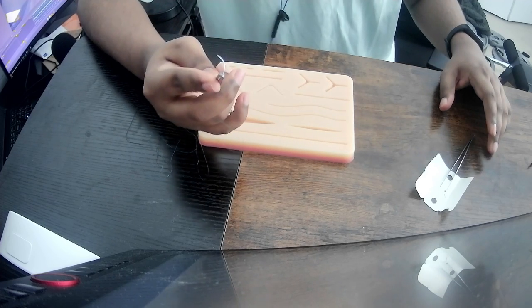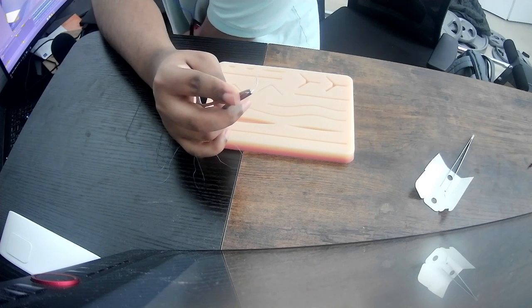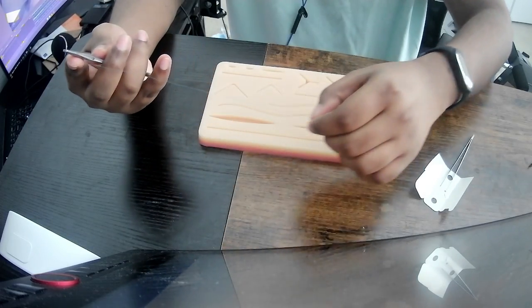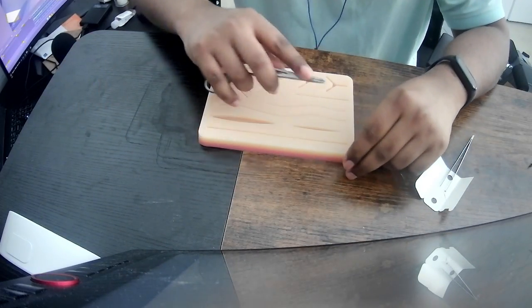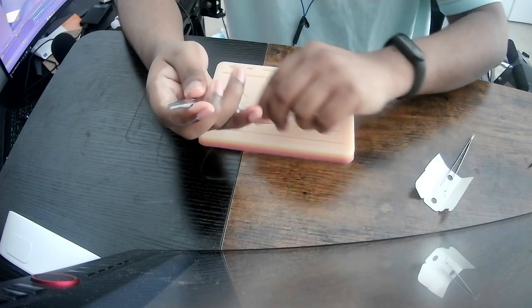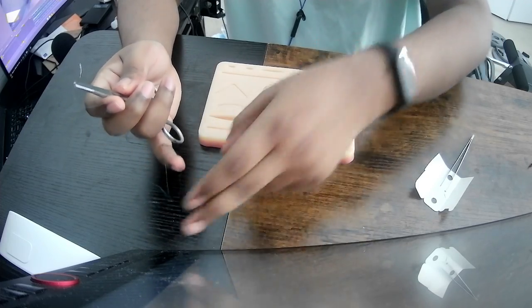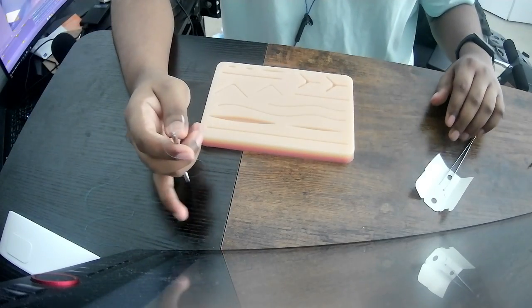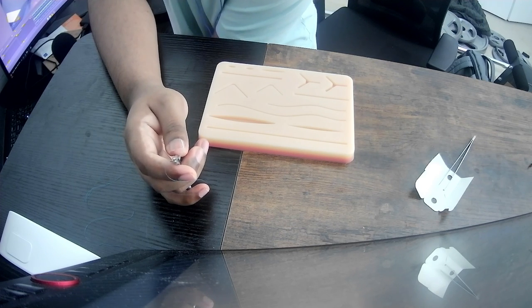Now, already, the issue I'm seeing is the actual suture. The one I have right now is kind of tangled, and it's getting in my way. I don't know how I would alleviate that. Maybe around my pinky, or maybe I'll move it away with my pinky. I don't know, we'll see. I'm sure I'll learn as I go. This is, of course, day one, building experience.